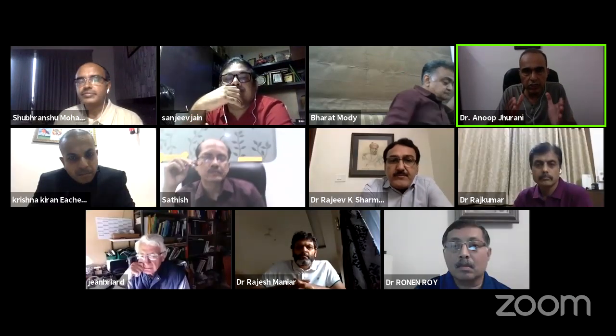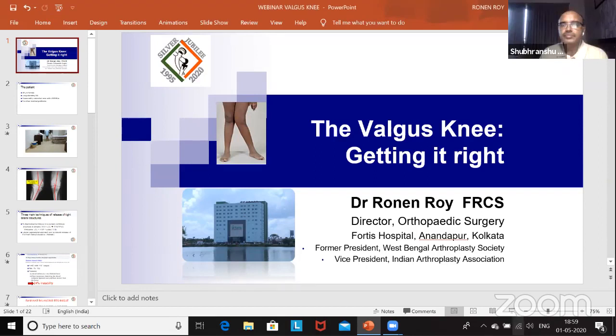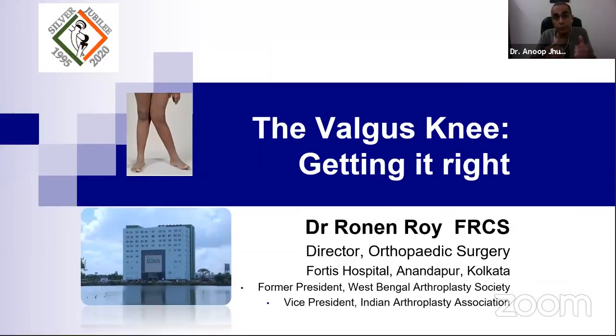So it depends on the deformity, and we have to do it under navigation preferably because we have a visual assessment. So our objective is to leave it in 1 or 2 degrees valgus and flexion of 5 or 6 degrees, and we'll keep doing pie crusting of the posterolateral capsule till we achieve that, after removal of all osteophytes. And osteophytes in a valgus knee are often underestimated. They are pretty much on the tibial side, which you don't see. So we have to remove all the tibial osteophytes.